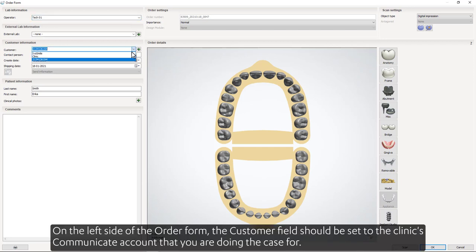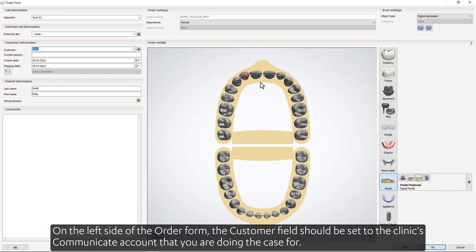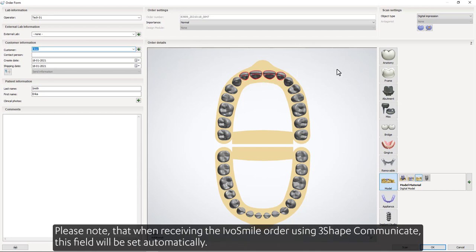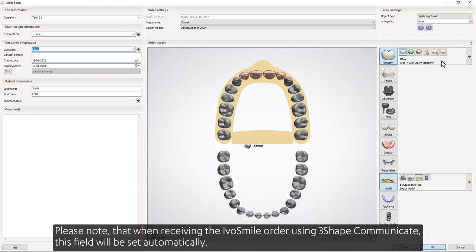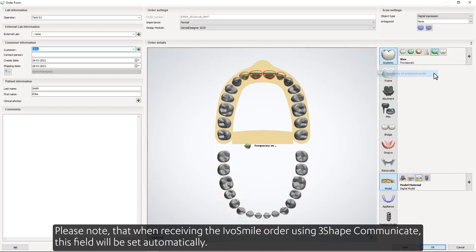On the left side of the order form, the customer field should be set to the clinic's Communicate account that you are doing the case for. Please note that when receiving the IvoSmile order using 3Shape Communicate, this field will be set automatically.